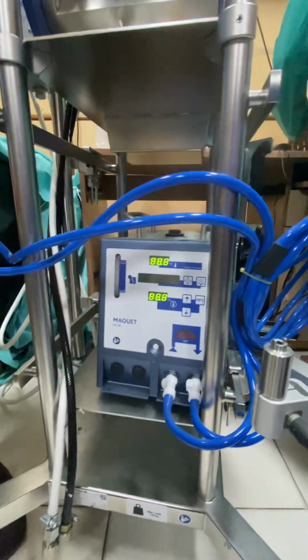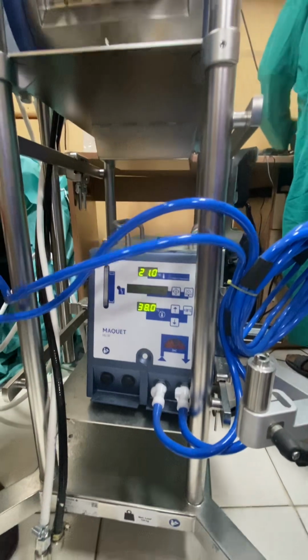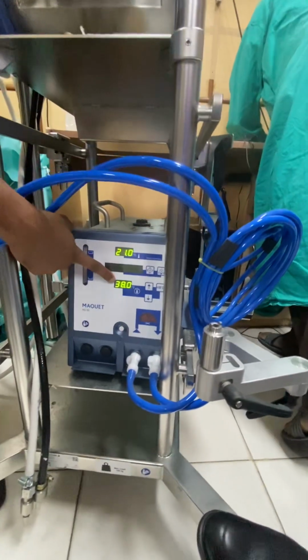ये सब चीजें चेक करनी होंगी ना. ये हमारा इसका वाला ही तो है ना. चाहिए होगा, I thought ये लेके आए हैं. So now it is 38.